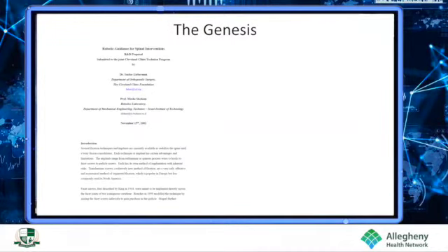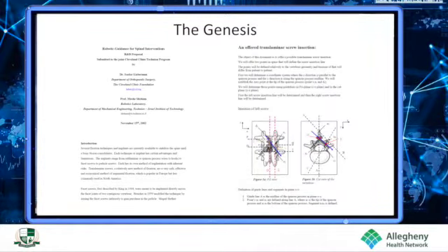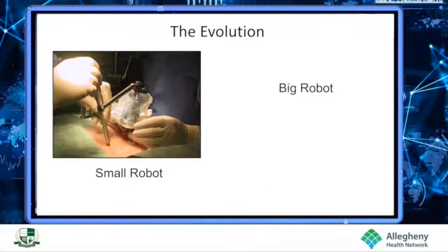Now, this was really the genesis of it. In 2002, Professor Moshe Shoham and I wrote this grant for robotic guidance for spinal interventions. It was an R&D proposal, and it was based on percutaneous translaminar screw fixation. And I thought that this would be an ideal way where we can minimize the insult. We can use some kind of robotic technology to place these screws to automate the surgery. In retrospect, this was a good idea, but using the robot for this was far more cumbersome than just doing it the way we used to do with a small mini open incision. So this was the fallout of it, but this is really where everything started.